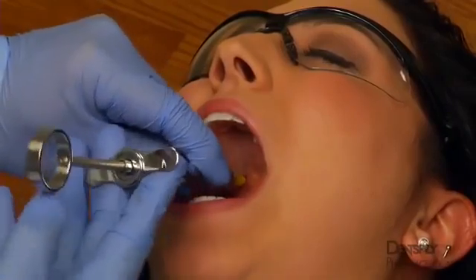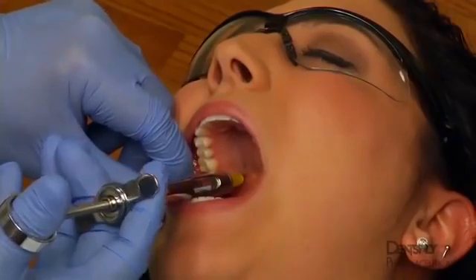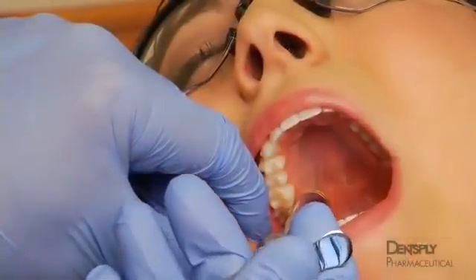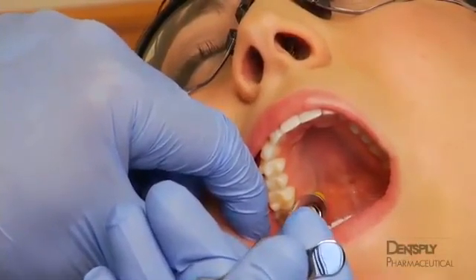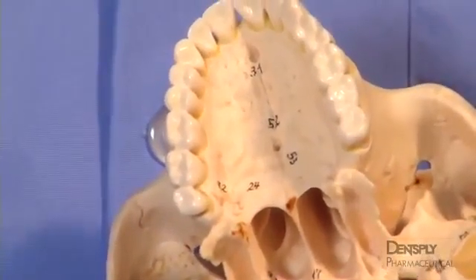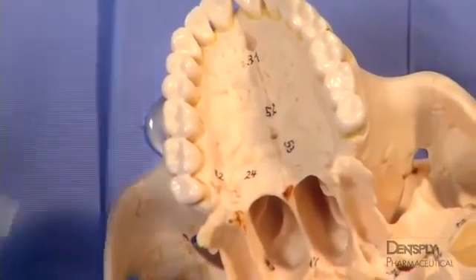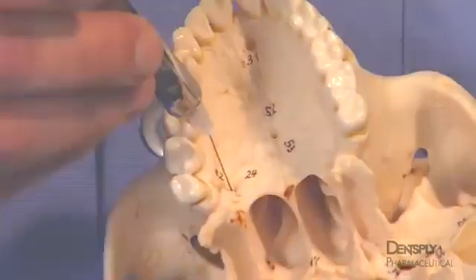The needle is never forced. If resistance is felt, the needle should be withdrawn slightly and advanced at a different angle. Following needle insertion to the proper depth and negative aspiration, a full cartridge of anesthetic solution is slowly administered. Perhaps 1/10 of canals have bony obstructions that may prevent passage of the needle. If the canal cannot be negotiated, then the injection should be aborted.